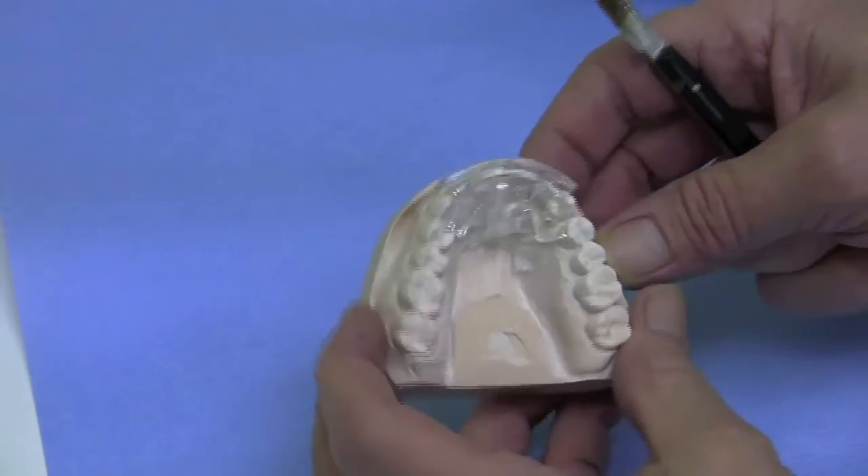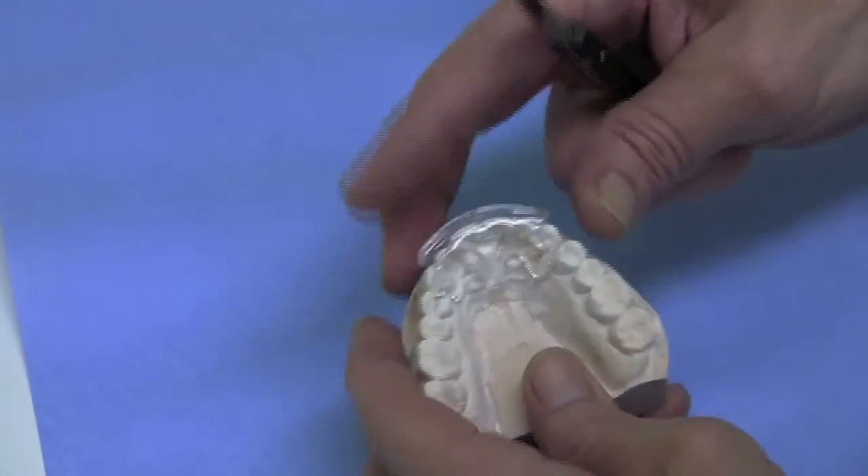Within a few minutes, you have a splint with improved adaptation and it is ready for relining.